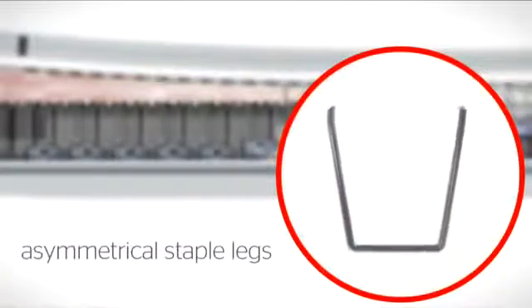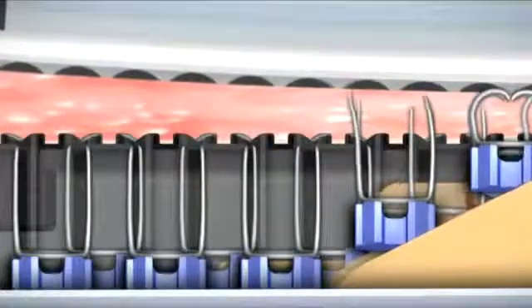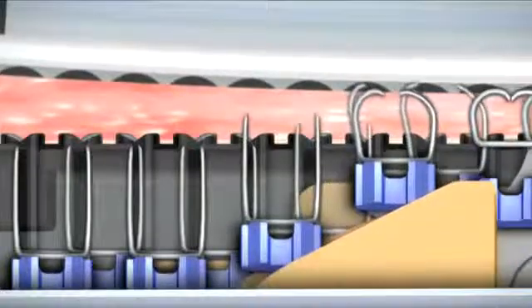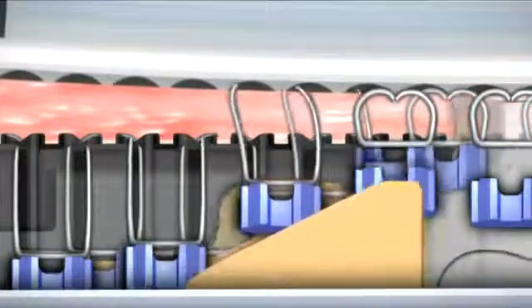Asymmetrical staple legs compensate further for tissue slippage effects on each staple leg due to tissue flow across a wide range of tissue thicknesses. A slightly increased bent staple tip on the distal leg improves the trajectory as the staples move toward the anvil pockets, resulting in fewer malformed or unformed staples.